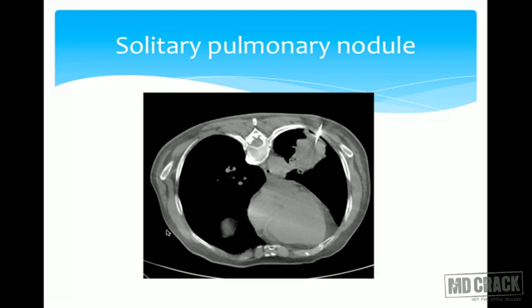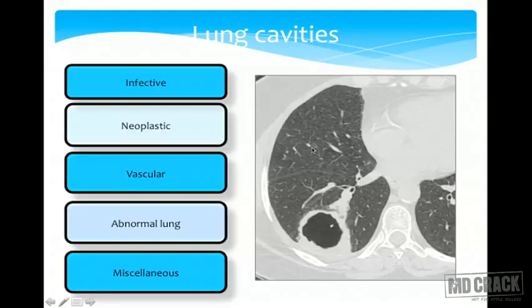This is commonly done using CT, like we talked about with CT interventions. The patient is made to lie down, and this is a lesion, and this is a needle tracking through the chest wall into the mass over here.